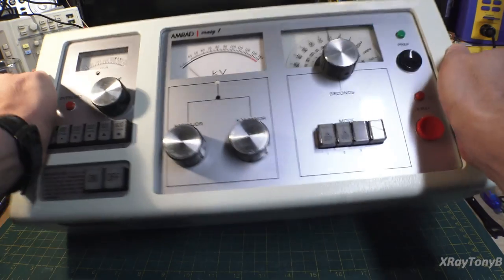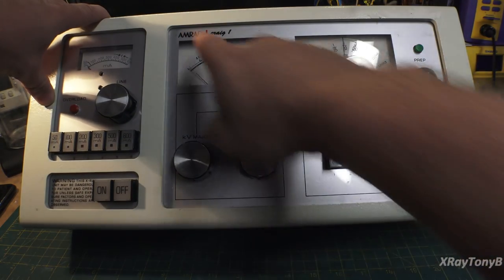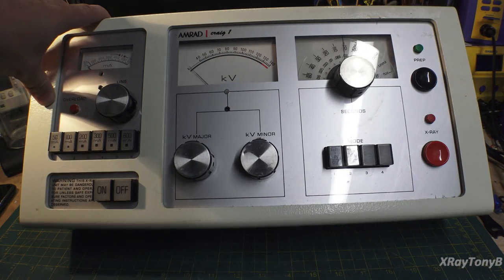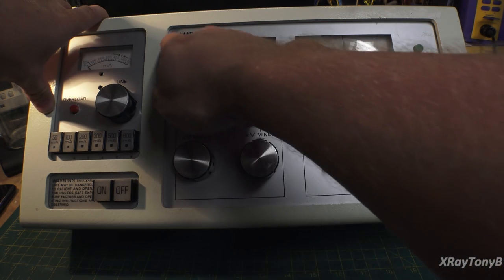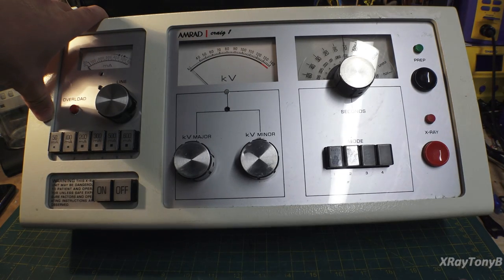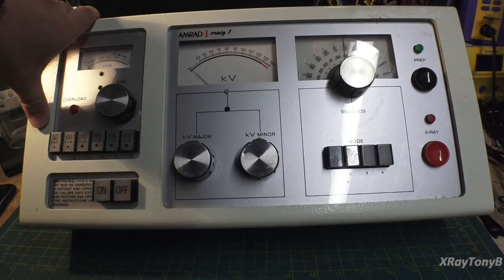So this is made by a company called Amrad. At least that's what they called it, Amrad. And funny thing about Amrad, it was actually owned by the Raytheon Corporation in America. And eventually, Raytheon dropped the Amrad name and just called the company Raytheon Medical Systems. Raytheon then got bought out by Fisher, and then Fisher got bought out by Hologic, and so forth and so on. And eventually, the whole operation got shut down.